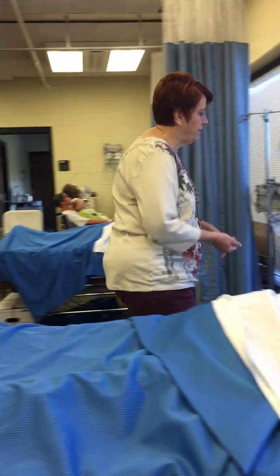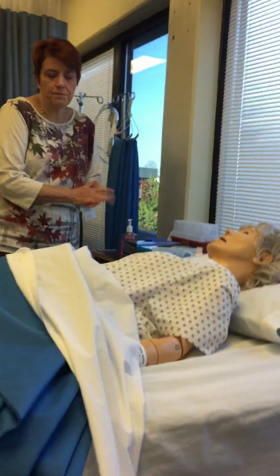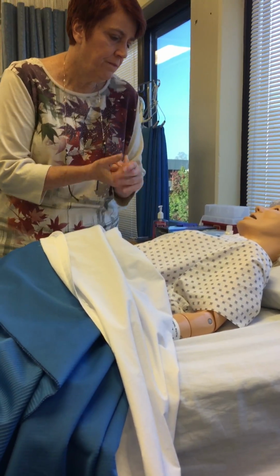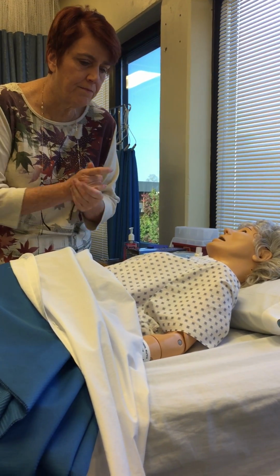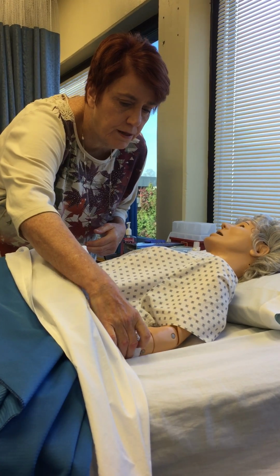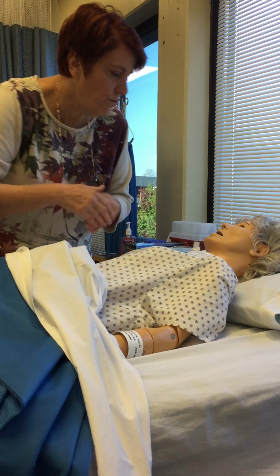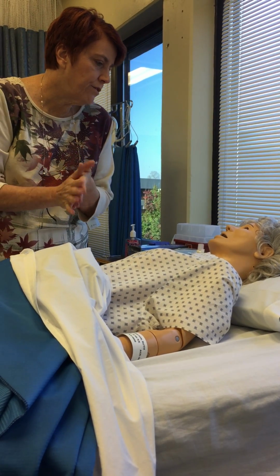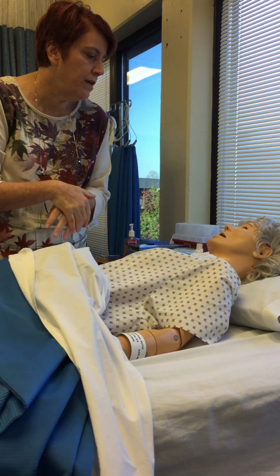Good morning, Mrs. Livingston. How are you doing today? Can you tell me your name? Let's see your armband. Ruth Livingston. 10854. All right.